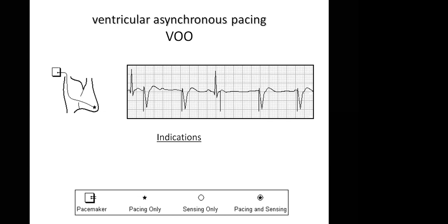I need the because. It's just pacing at the regular interval, so there's no sensing. It's just pacing. It's just ensuring that the ventricle is being paced. That's all.